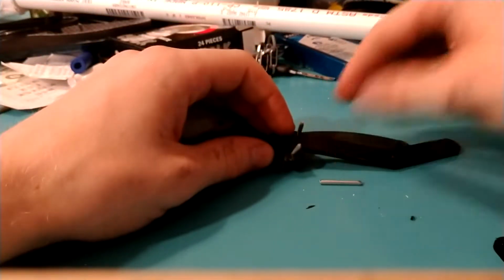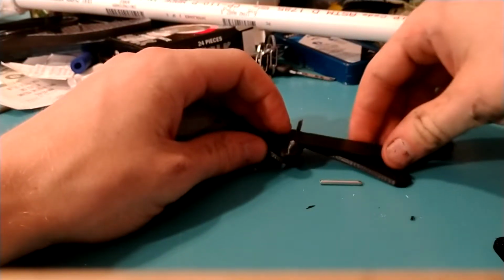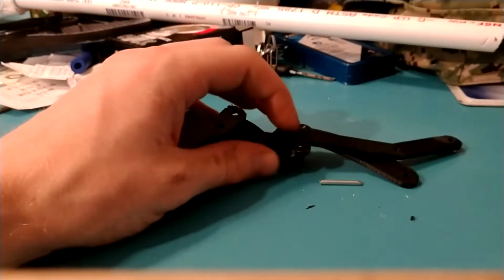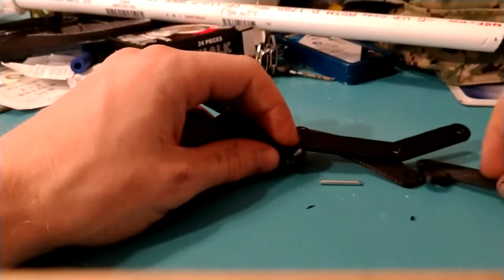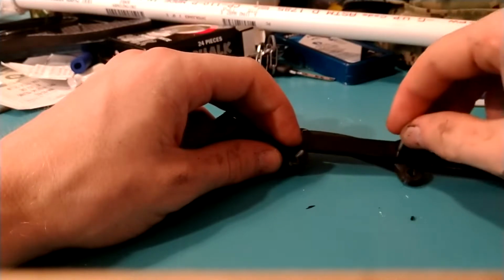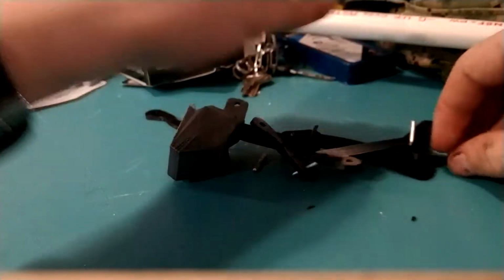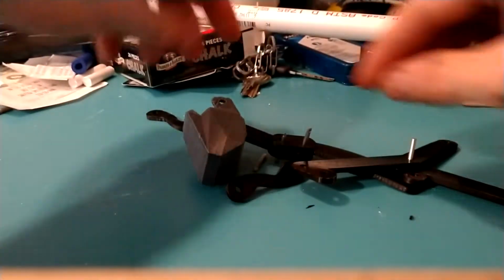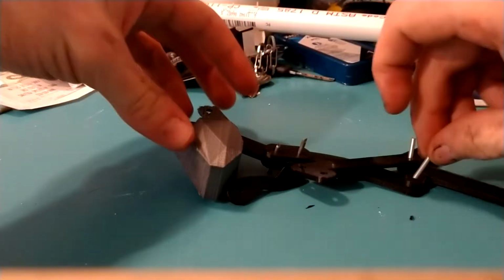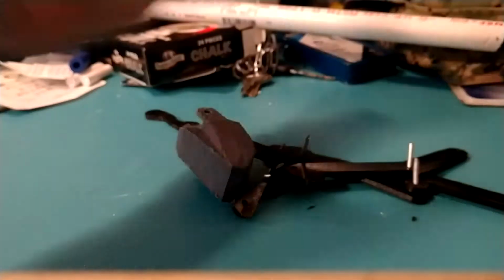Now this piece right here in the back, that's going to come forward and under, and then this piece right here is going to sit between the two and mount right in the middle there. And then this is falling apart because I'm videotaping and in an awkward position, but then it'll go right there.